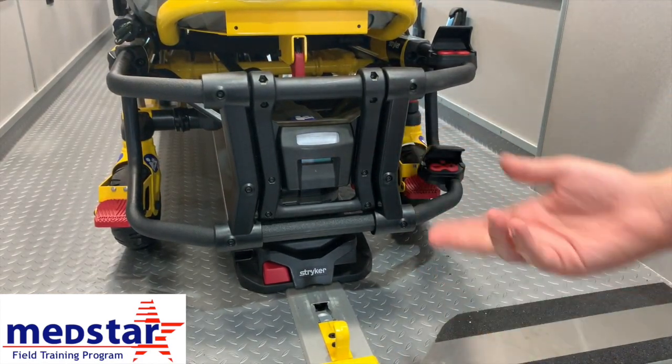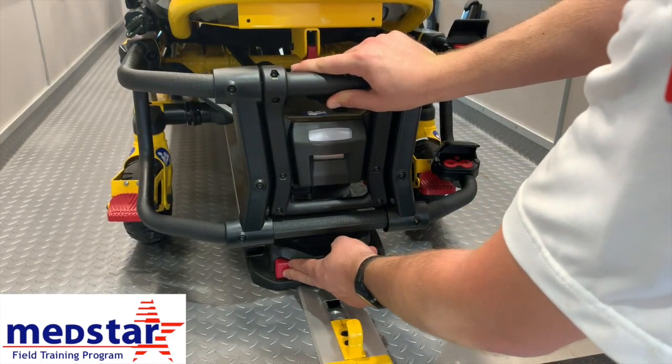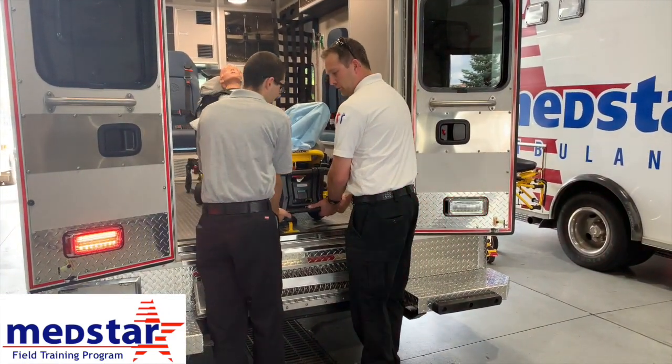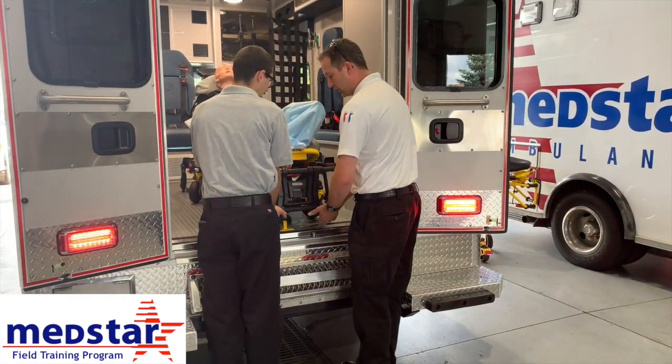To unload the stretcher, take some pressure off by pushing in a little bit, then push the red button — you should hear it release. Start to pull the stretcher out. You can unload it with one person or two. We're going to show you with two. You can put a person on either side. Make sure you lift the bumper so it's out of the way when you go to drop the wheels on the stretcher.